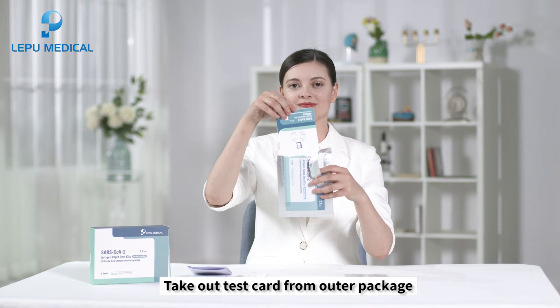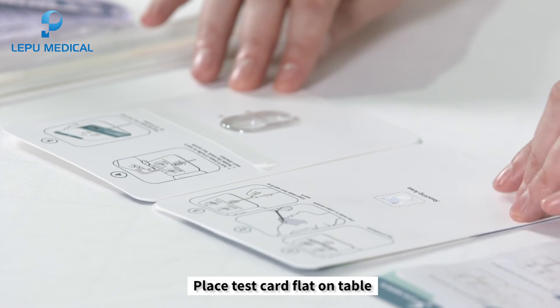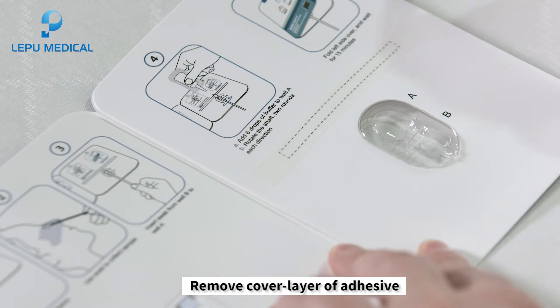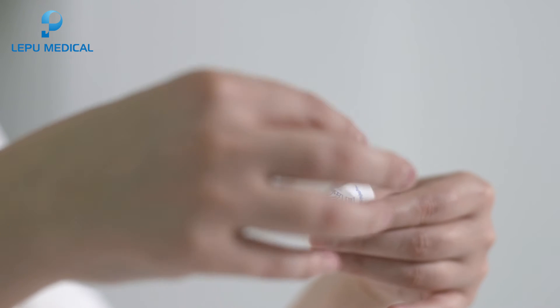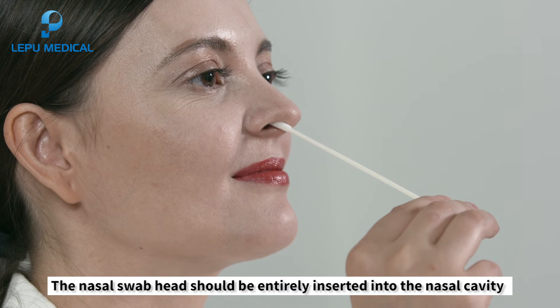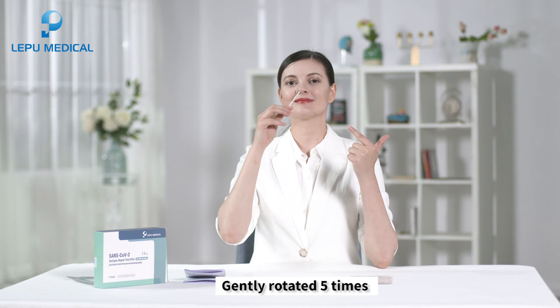To operate the test, take out the test card from outer package and place it flat on the table. Remove the cover layer of adhesive. Take out the swab from the stick end. The nasal swab head should be entirely inserted into the nasal cavity about two to three centimeters and gently rotated five times.